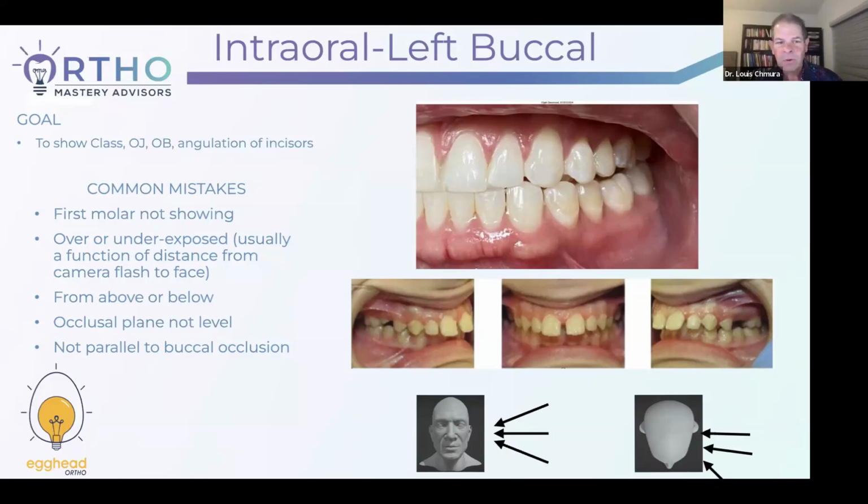Again, you can overexpose, underexpose, all the same sorts of things. The main one, though, is orientation. On all the intraorals, it's orientation.